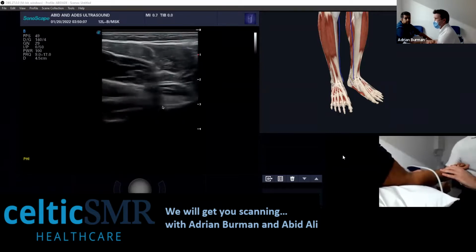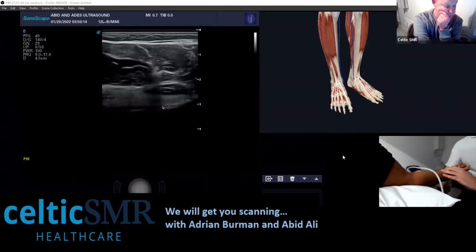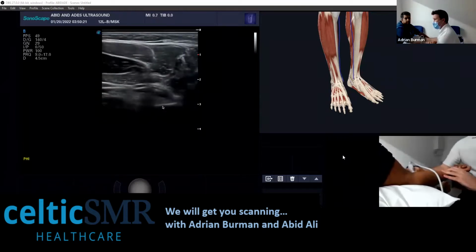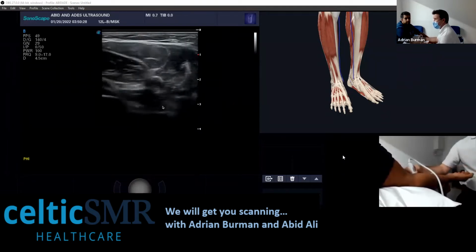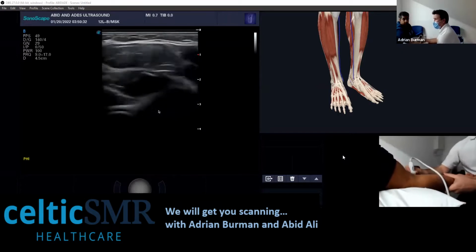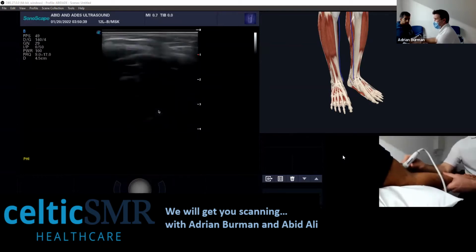And finally, you'll find it easy on someone and then not on another. So it's just a matter of playing around with your technique until you find it. Okay. You can see that nicely inserted there. If you go transverse, you can sometimes see both of them together. Get a nice soft speed. These two down here, but I'm losing it now. So come down.